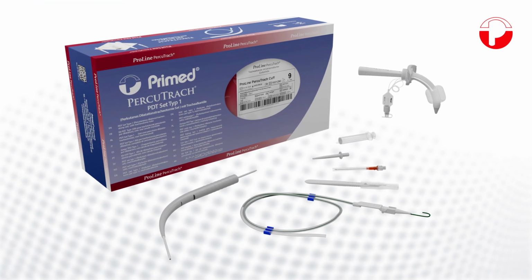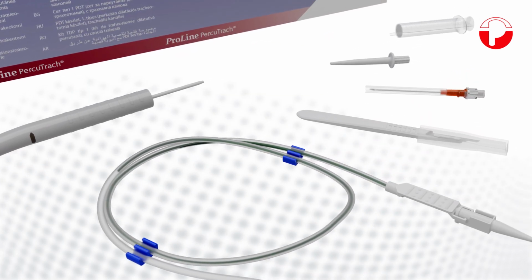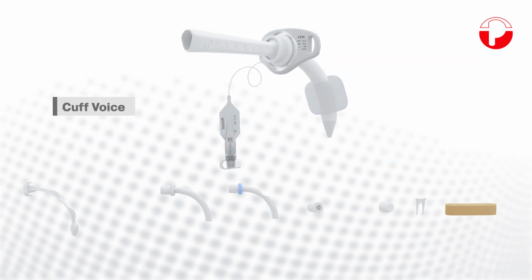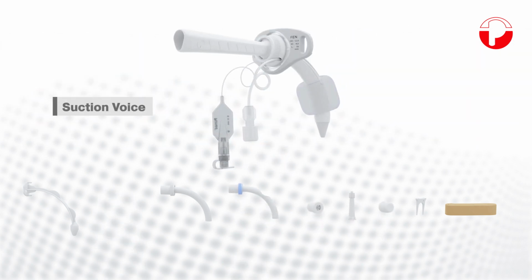The PercuTrach PDT set for stepless dilation is available in various versions. The dilation set can be combined with a ProLine tracheostomy tube. Cuff. Cuff voice. Suction. Suction voice.